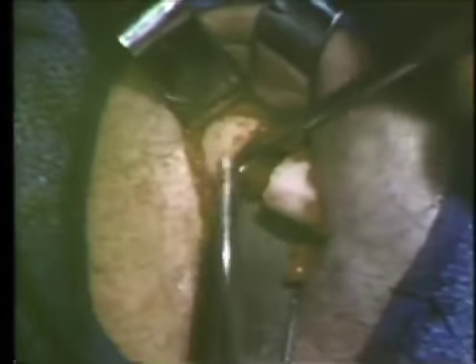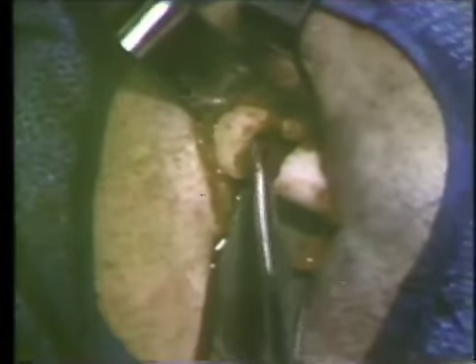So this rather meticulous work of guarding and protecting the nerve and doing this little bit of expansion through the relief of adjacent bone is better done before things are moving around. Similarly, these holes for transosseous wire fixation are better placed here and now while the fragments are stabilized than when they're moving around.